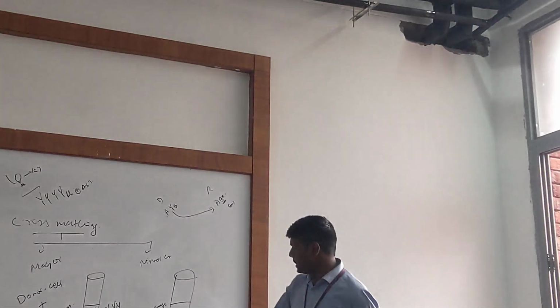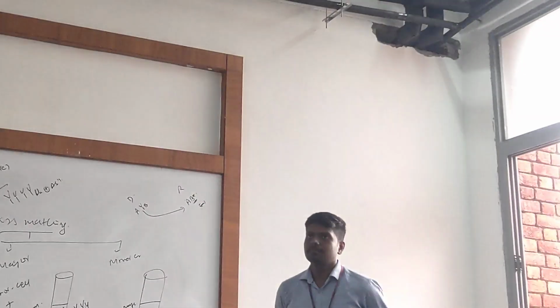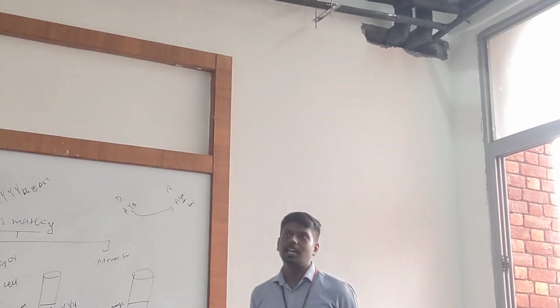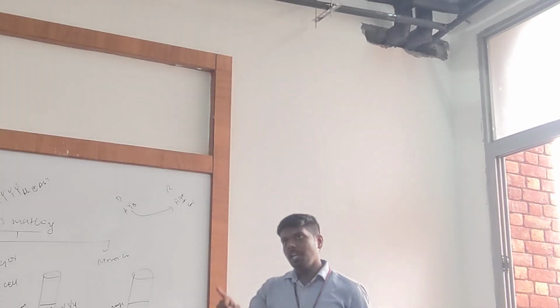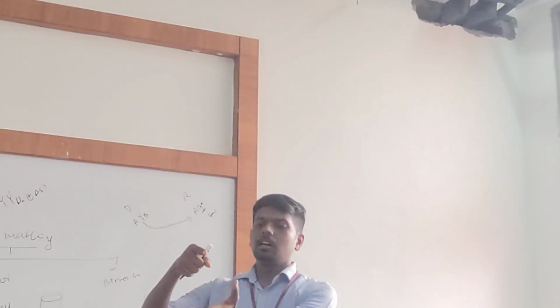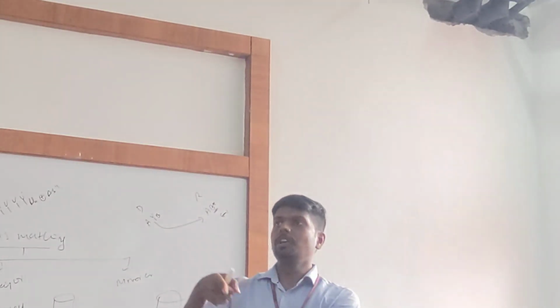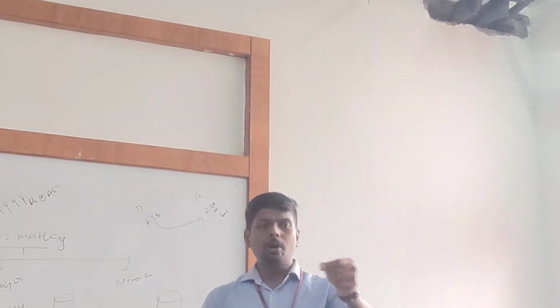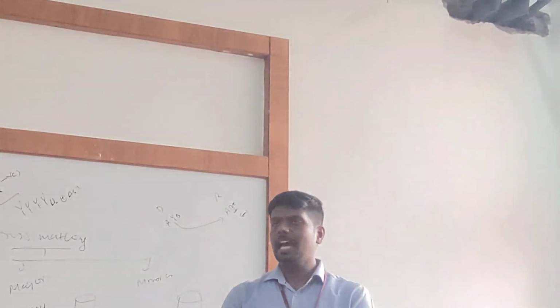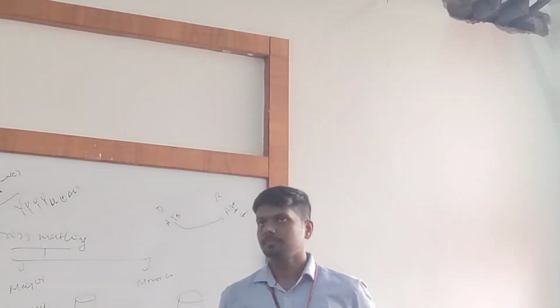Okay? So this is the concept of cross matching. Now you understood the significance of cross matching, right? So before even transfusing the blood, take a slide and mix a recipient serum with the donor cells. A drop of recipient serum, drop of donor cell. Okay? If any reaction happens, don't transfuse it.